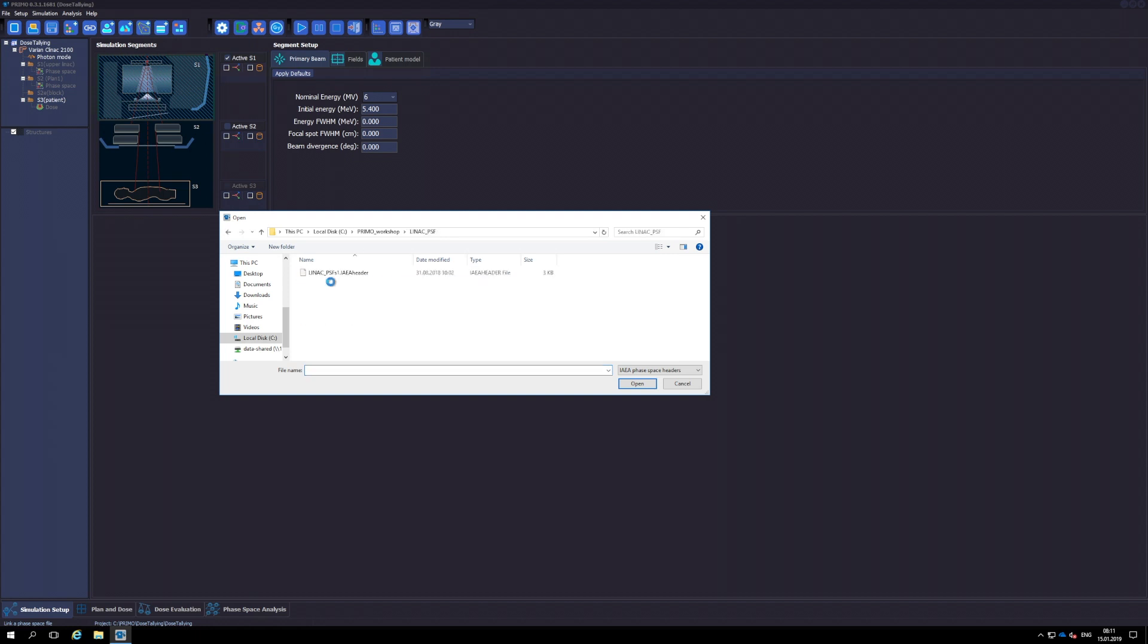The directory where the phase space file is located must contain the binary file with the phase space and the header file. Only the header file is shown in the browser.